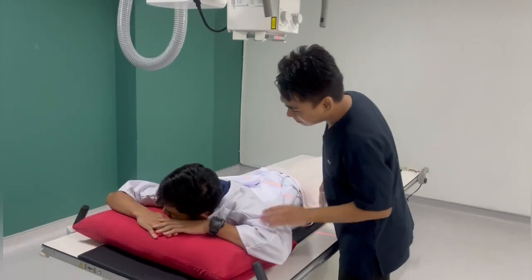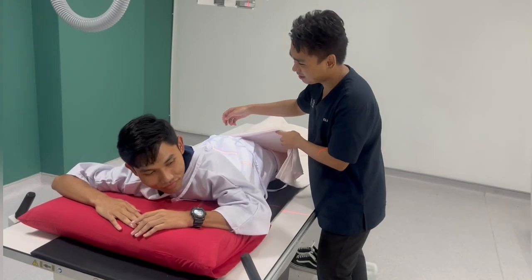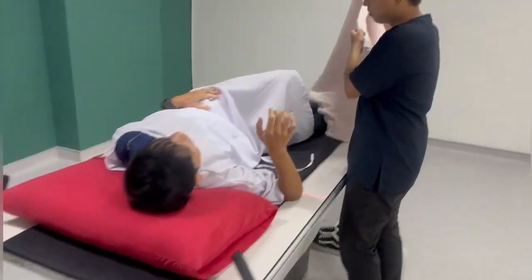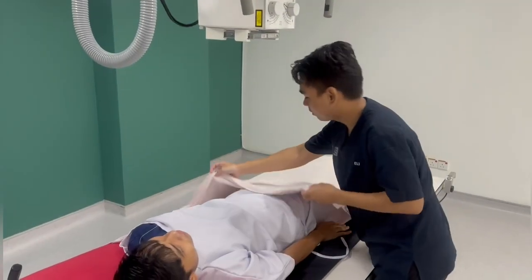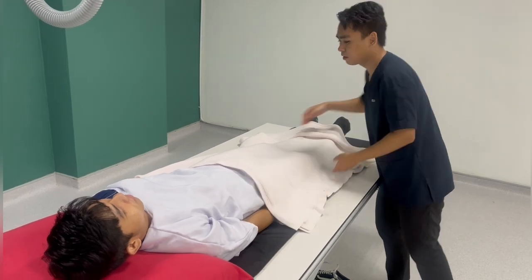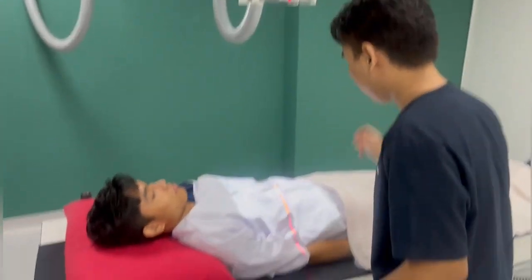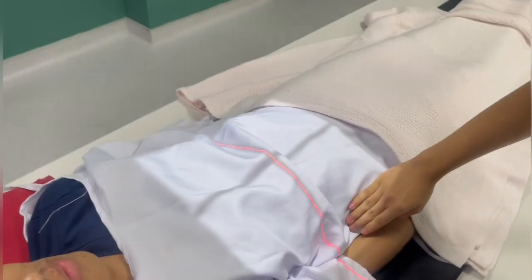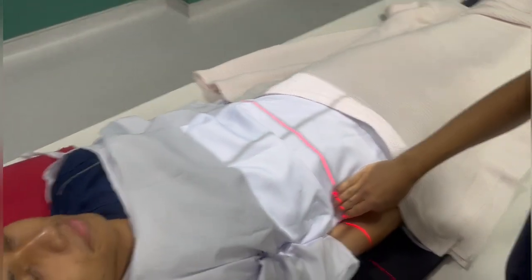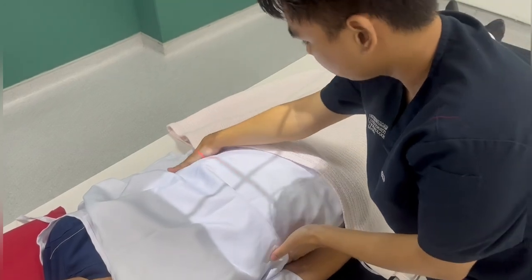Now we're going to do the AP projection of the abdomen. We ask the patient to turn around for the AP projection of the abdomen. As with the previous one, cover the patient with a blanket and adjust the patient. Ensure the MSP is centered to the center of the table. The center point for this projection is also the same, which is at the midpoint of the level of the iliac crest. So palpate the iliac crest and center at that level.